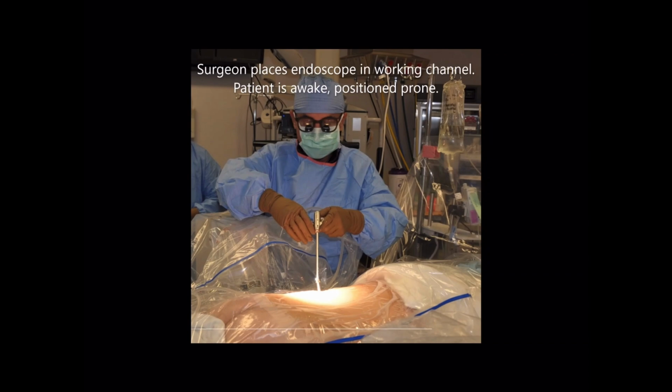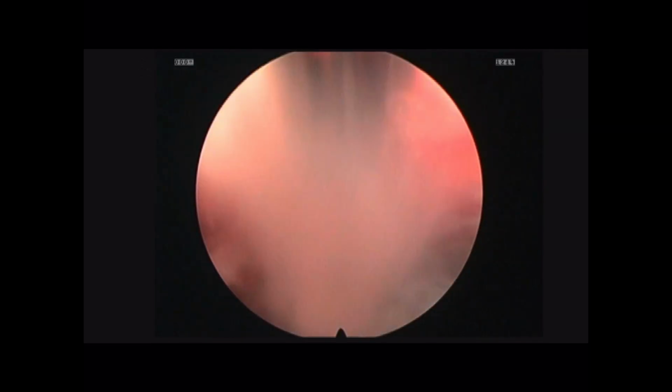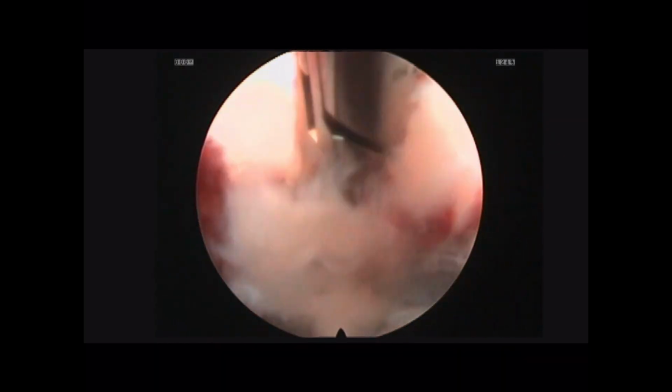The initial view upon insertion of the endoscope often looks similar to this image, and cautery may be necessary to control any bleeding and enhance the view. We then perform the discectomy using a series of instruments, including the graspers seen in this video. We utilize several different instruments to assist with the discectomy.